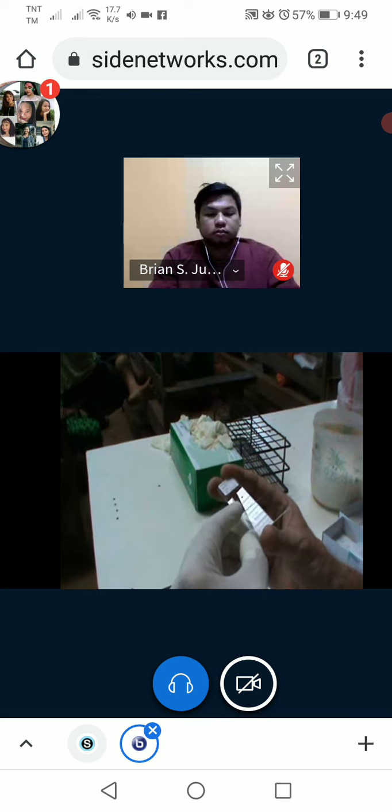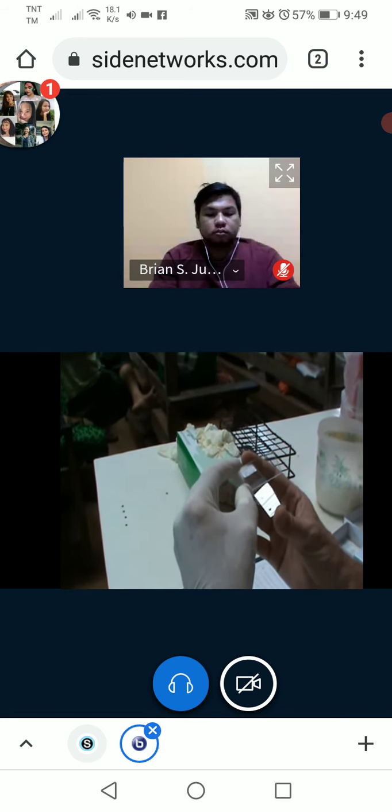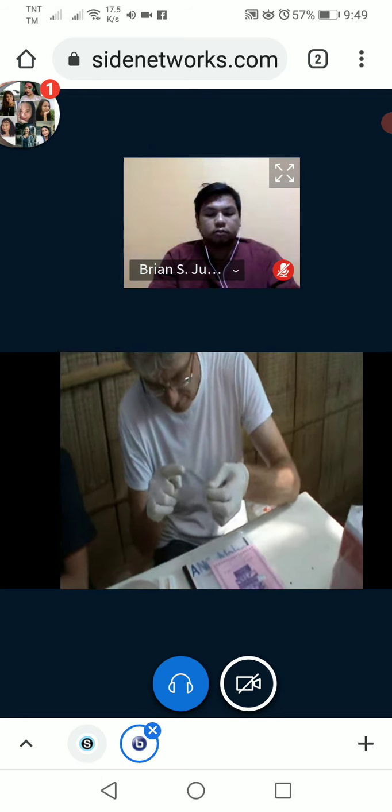On a well-performed thin smear, the tail of the thin smear should dry very quickly, and looking through, you should be able to see rainbow-like colors in that area. Here, I complain with my staff who forgot to clean the spreader after smearing.